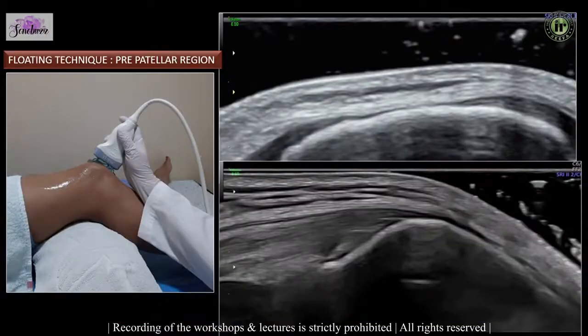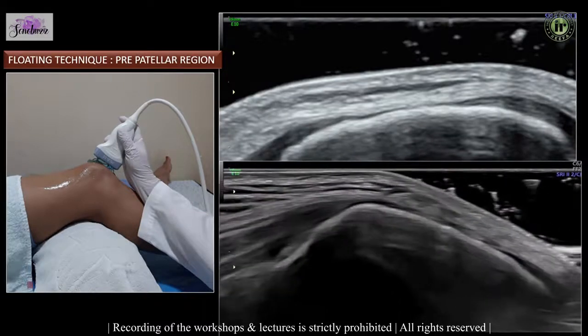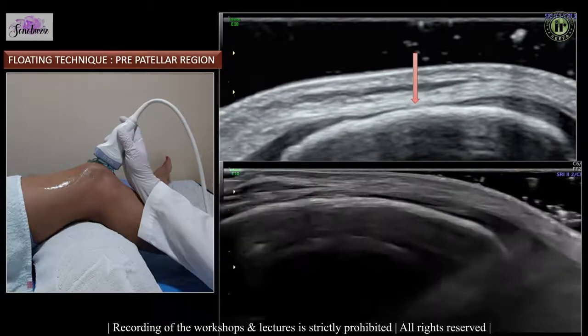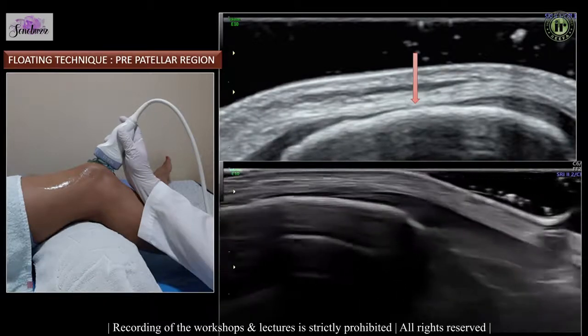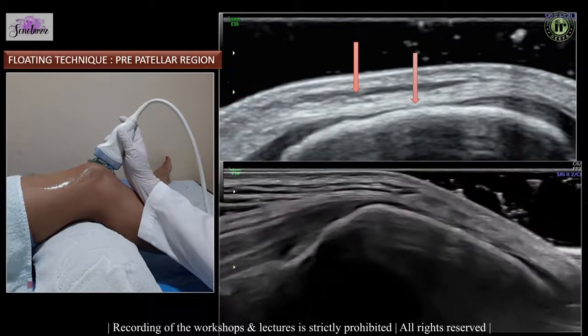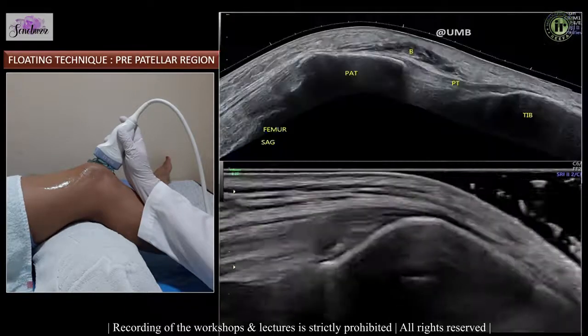In the prepatellar region, we use a floating technique. That is, we put a lot of gel over the patella and put the probe very lightly over it to avoid any compression, so that we can visualize the superficial fibers from the rectus femoris crossing over the patella and joining the patellar tendon below. Also take note in this area of the prepatellar bursa, which is usually not seen in ultrasound normally if it is not inflamed and distended.